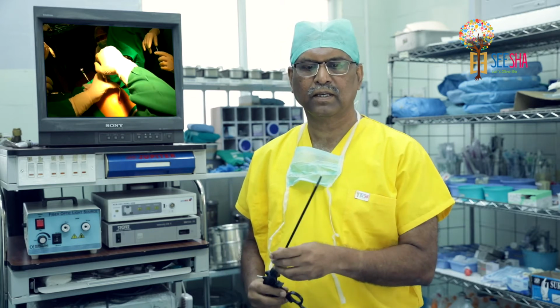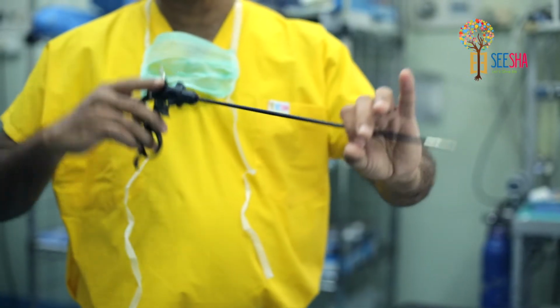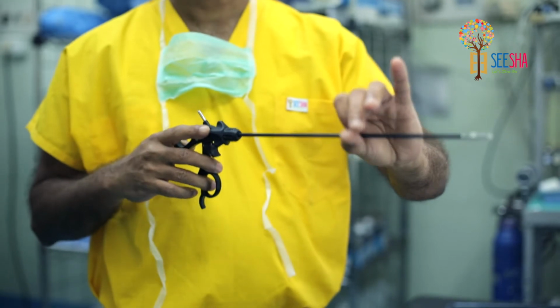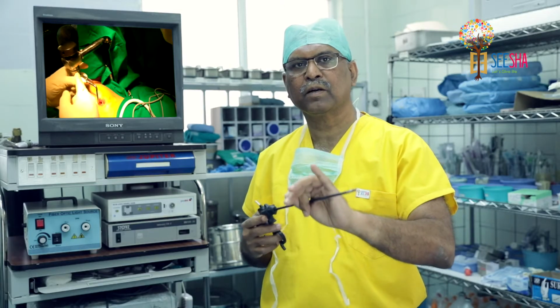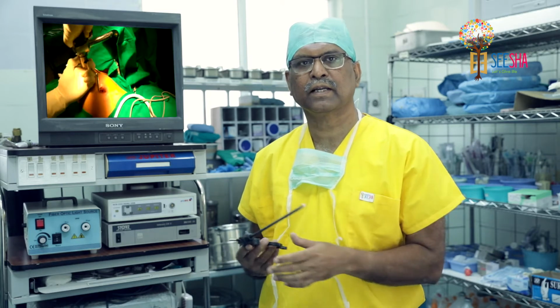During the surgery, these are the common instruments that we use. This is an atraumatic grasper we use to move the intestines away from the area of interest. Sometimes it's useful to put a uterine manipulator so that the uterus also could be moved in whichever direction is necessary.